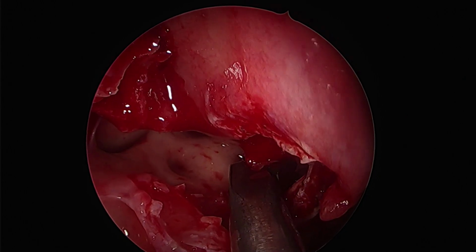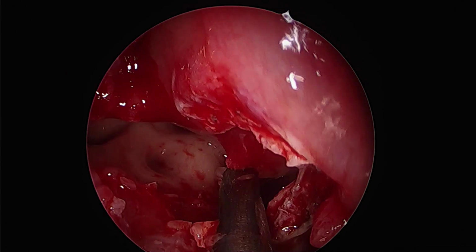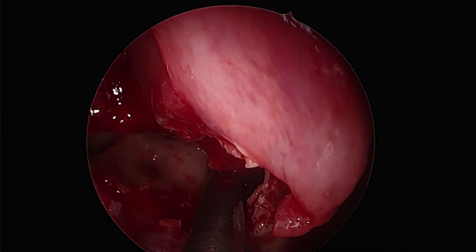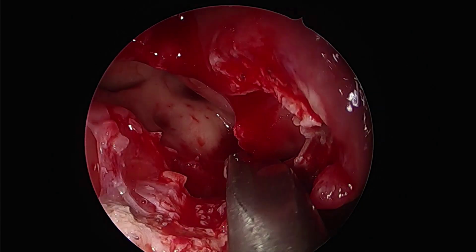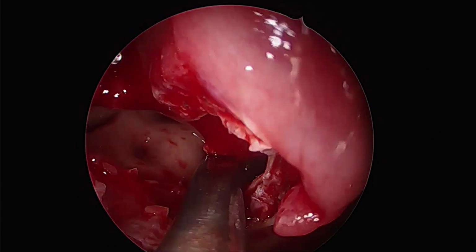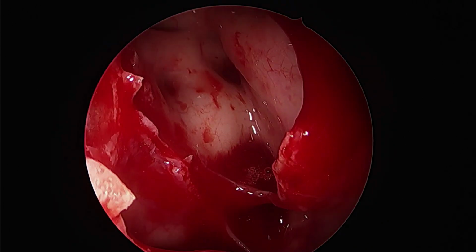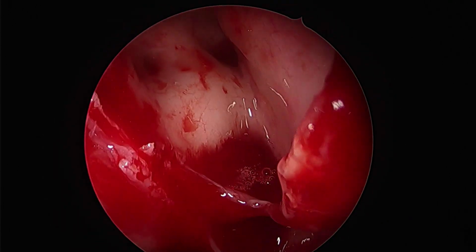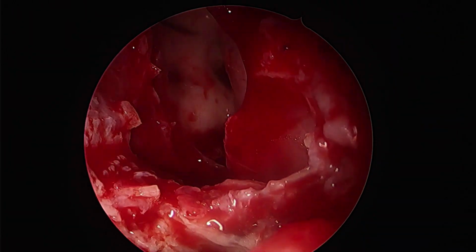What you might also appreciate is that unless we would have taken down this amount of sphenoid wall, entering into this cavity and dissecting would not be possible. While merely visualizing with the straight or angled endoscope is possible, instrumentation and dissection inside the cavity requires a much larger space.